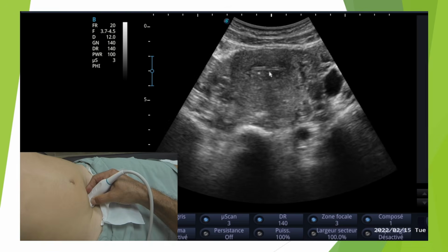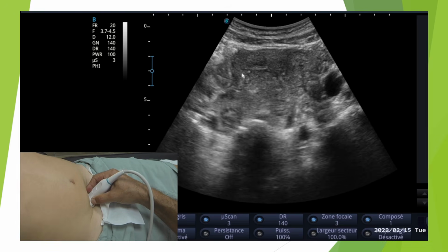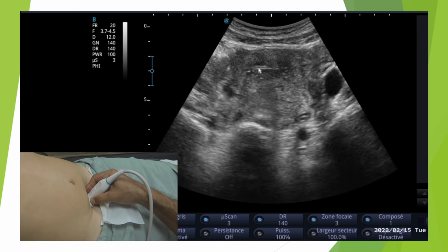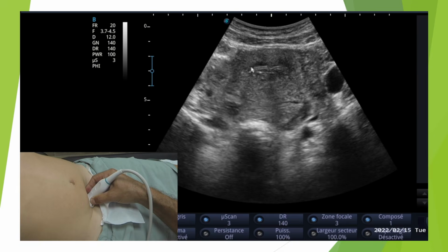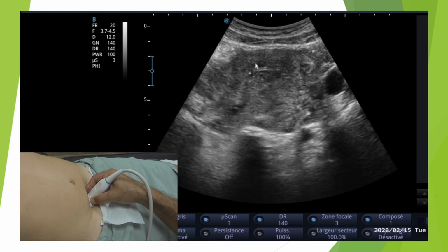So, for example, we don't have an IUD that's poking out over here, completely off to the side, which would have perforated the myometrium when the IUD was inserted. Here, we have an IUD that's perfectly centered, very well positioned here in our uterine cavity. You can see here we have the endometrium and here the myometrium.